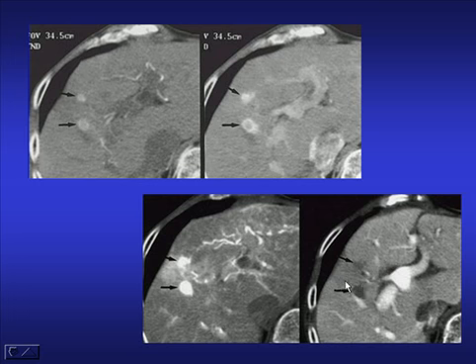This involved arterial cannulation when transferred to the CT scanner and rather fell out of favour, and we can get almost as much information today with modern CT scanners from a rapid intravenous bolus, although there is some blurring between the two, the arterial and portal venous phases, but with practice diagnostically we can do almost as well.